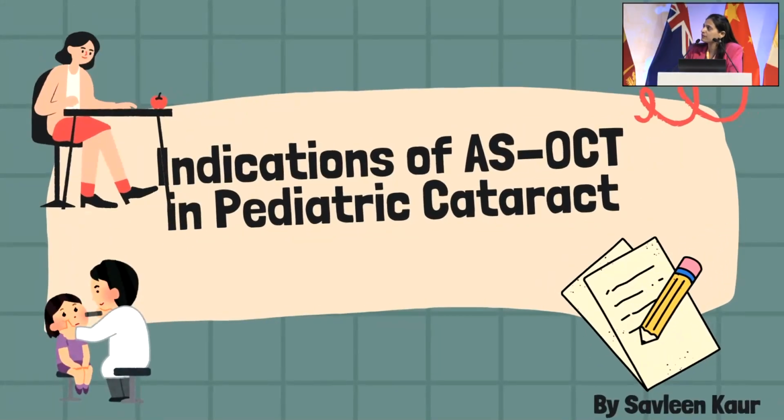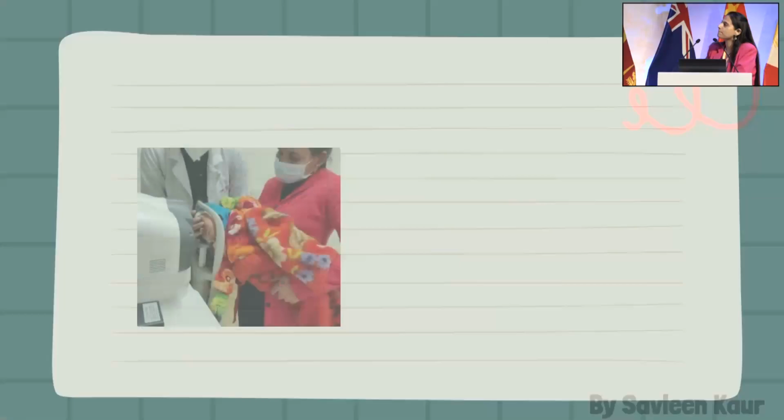Good morning, everyone. In contrast to the others, I'm going to show a diagnostic technique and a tip so you can carry this home. This video demonstrates the use of anterior segment OCT for pediatric cataract surgeons.